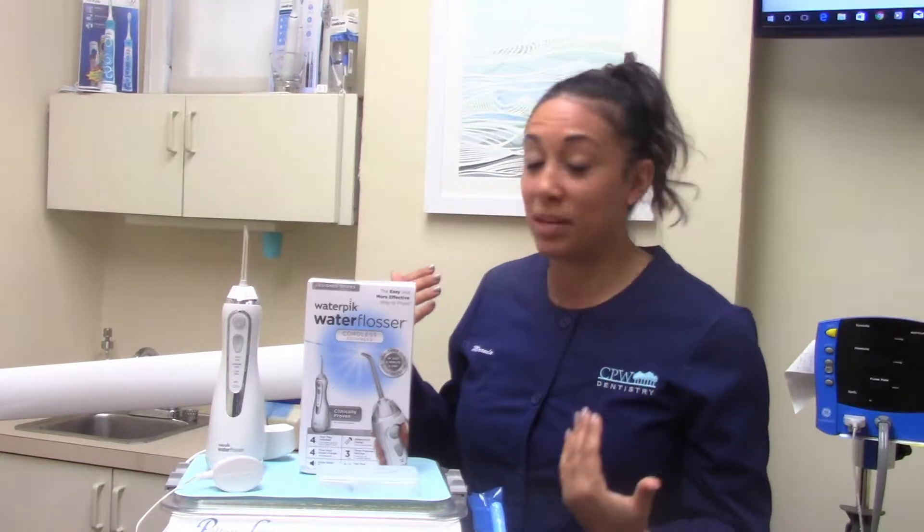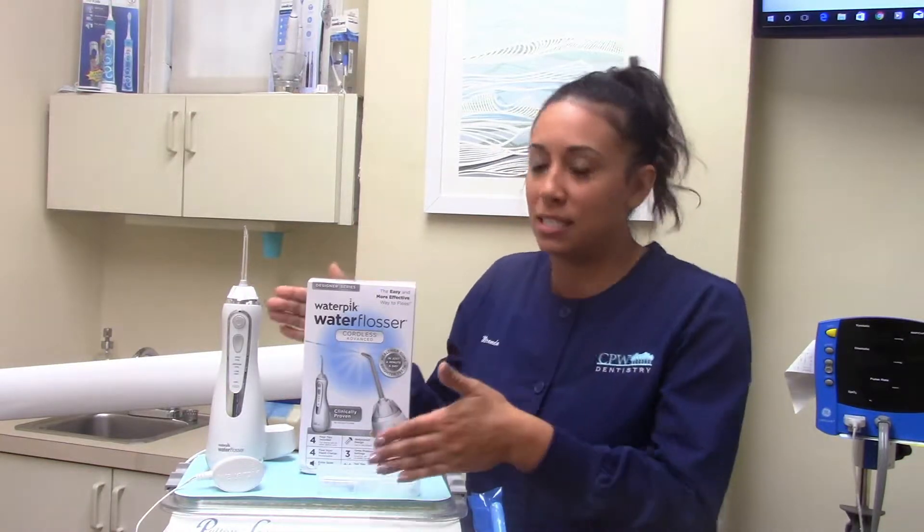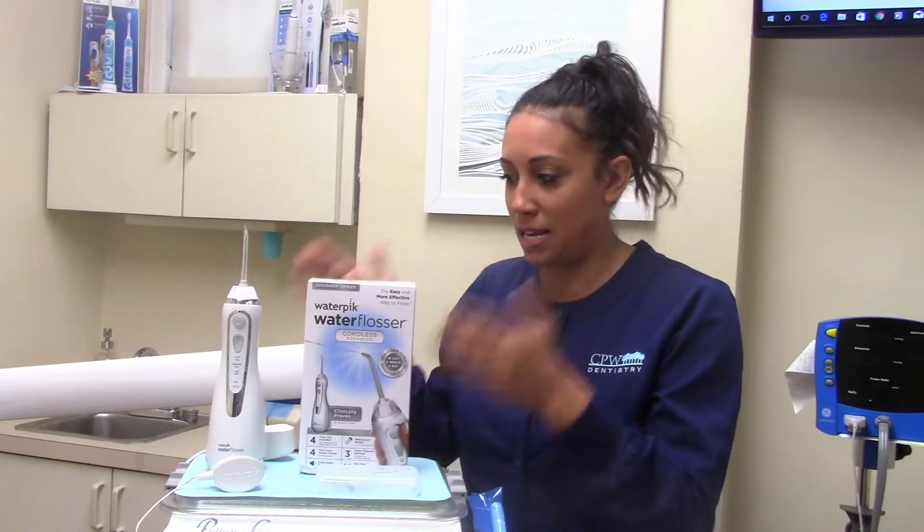Sometimes it's a little complicated, but once you get the hang of it, it's really easy. We love the water flosser here at CPW. I personally really love recommending it to my patients because a lot of patients don't take the time or they don't like to floss. So this really is the next best thing. I highly recommend manual flossing — I think it's the most effective — however, if you don't like to floss, use the water flosser.